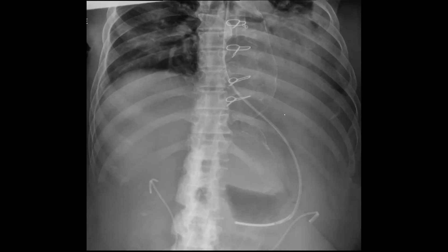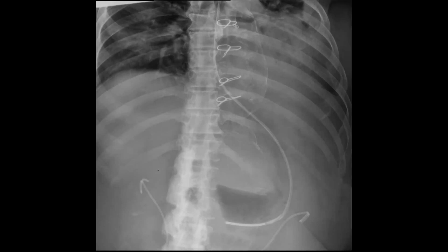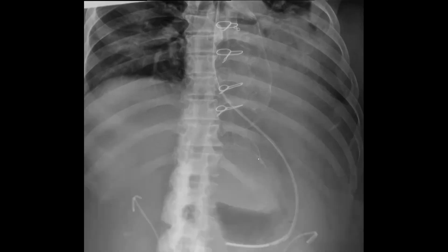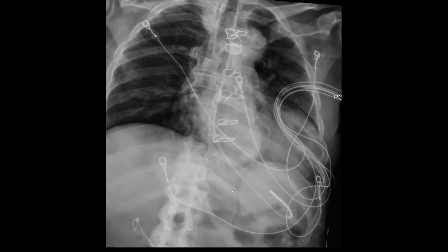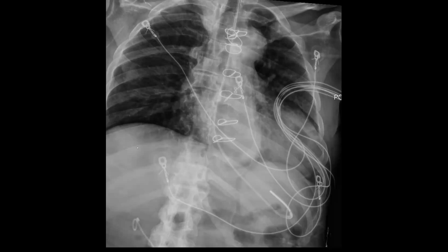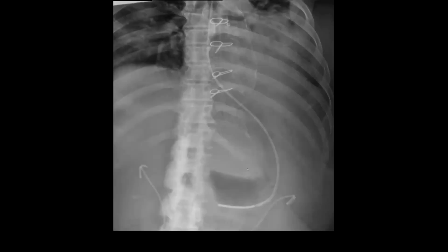So this is my case. There was something abnormal in the lower left paramediastinum, which there is — a calcified ectatic aorta here. Going down into the abdomen we can see some calcification. This was the patient a few months earlier, and you can see the calcification is not as prominent, but the aorta is going over here and the calcification down here is more medial.